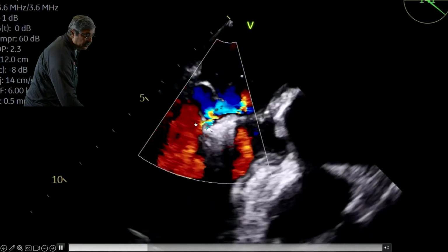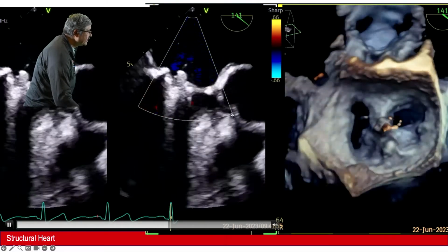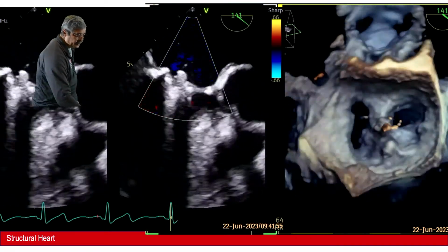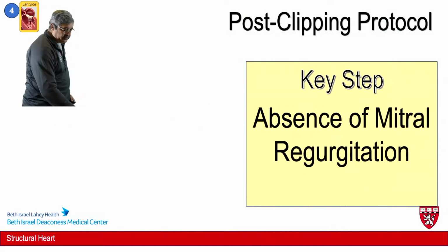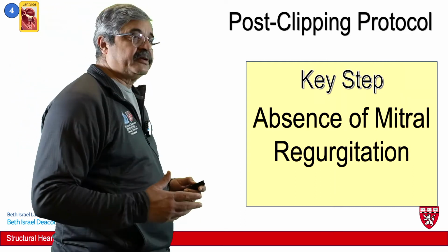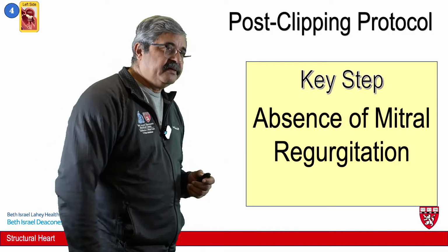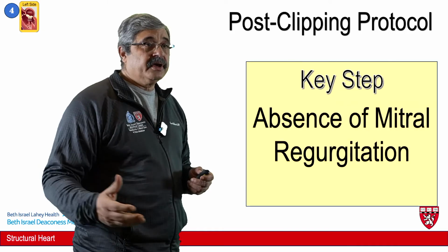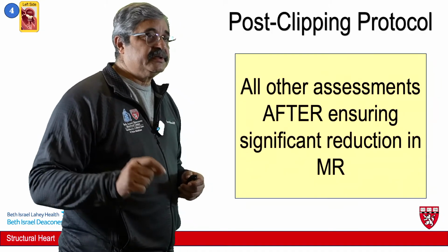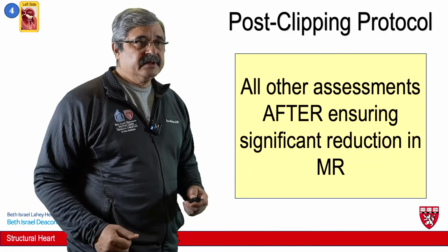Now, as you can see in this specific case, we also confirm this position with 3D imaging to see that the clip is located in the right place and at the target where we wanted it to be. Now, the key part in this whole process is that absence of mitral regurgitation has to be established after the application of the clip before we do any other thing, because you could have a great grasp, you could get the leaflets very well, but still be at the wrong location and completely miss it and have significant residual regurgitation. So post-clipping, all of the assessments are done after we've ensured that there's significant reduction in MR, because if there's none, then we've obviously missed the target.